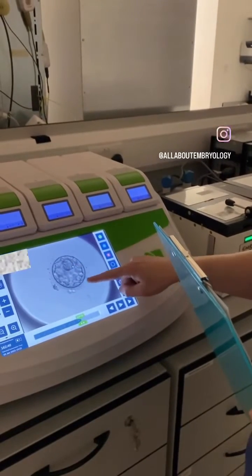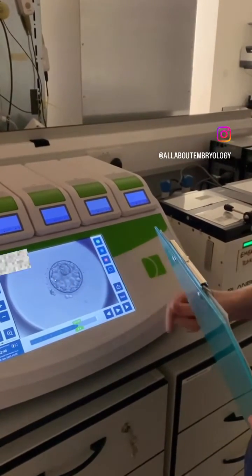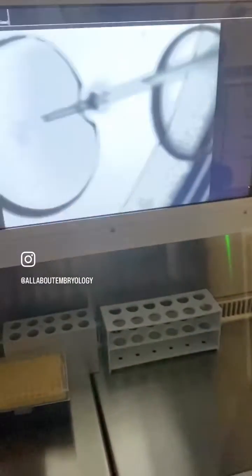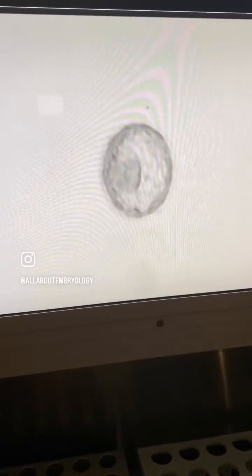Just before the transfer, the embryologist will grade the embryos for their quality and will select the best embryo or embryos for transfer. For this patient, one top quality blastocyst was selected for transfer.